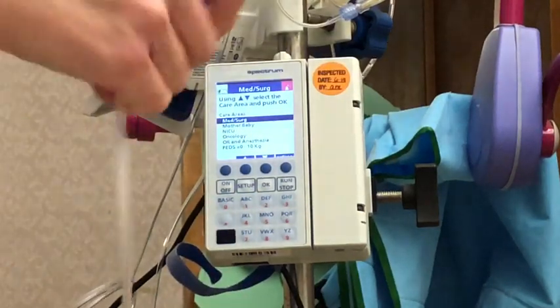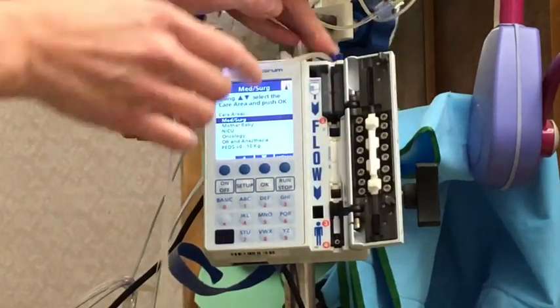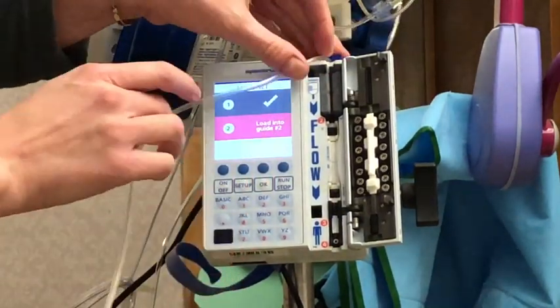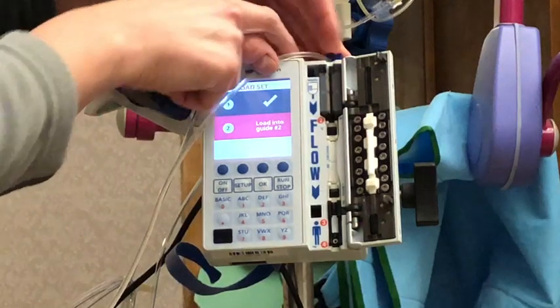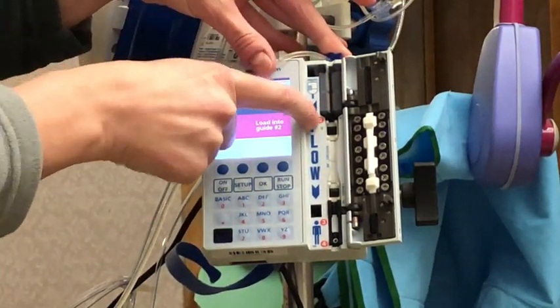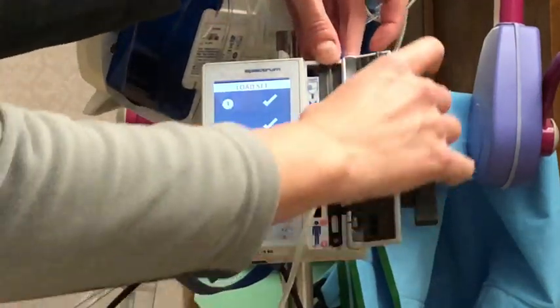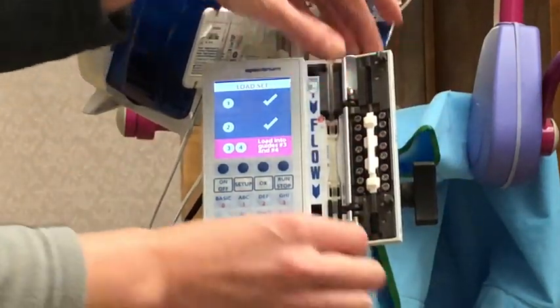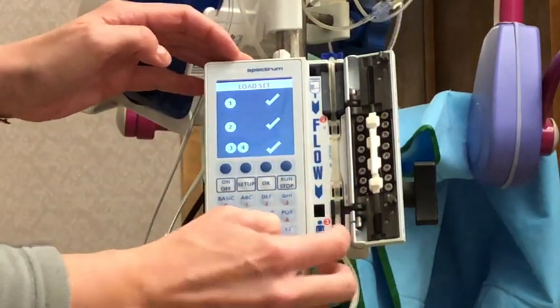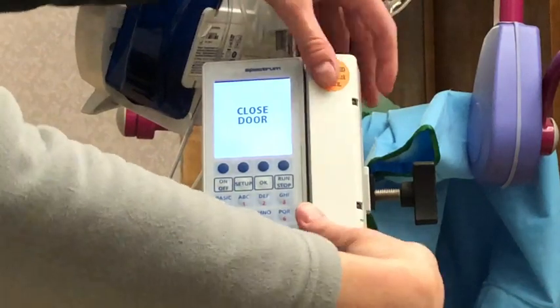I have my IV tubing here, and essentially I just pop that in — that's going to open the door. You can see there are four touch points: the first touch point is up at the top, then two, three, and four. When you're putting it in, you want to be sure you're hitting all those touch points. It'll turn green once all have been hit, and then it'll tell you to close the door.